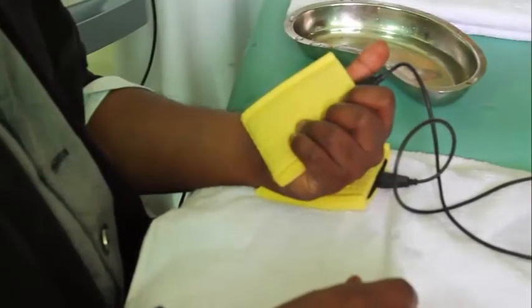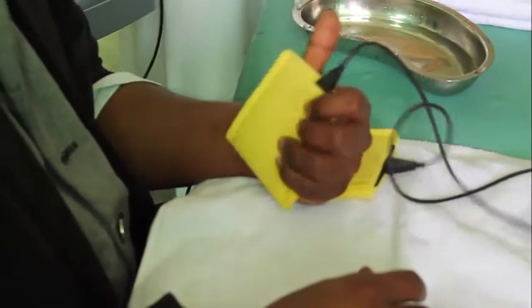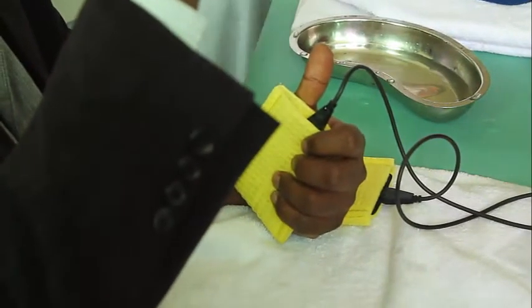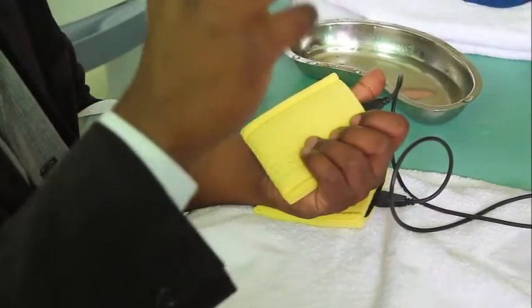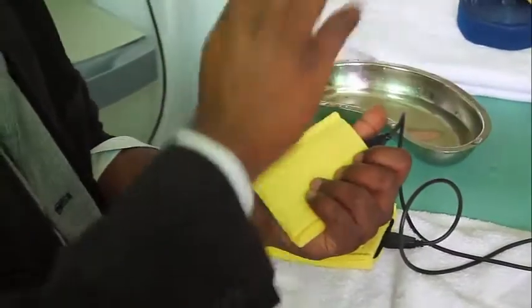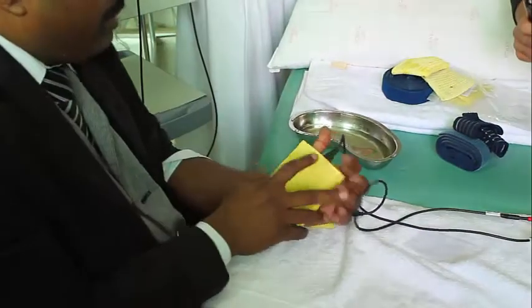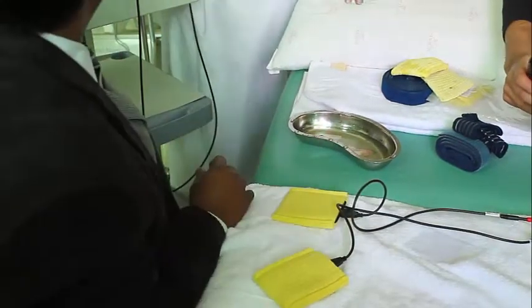So I keep it like this. Two layers in cathode. Whichever touches my skin should have 2 layers, one from below and one from above. So wherever my skin touches the electrode should have 2 layers. Now I'll show the machine, how to select, then I will start with the current.